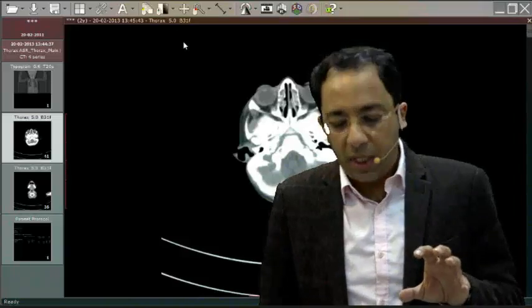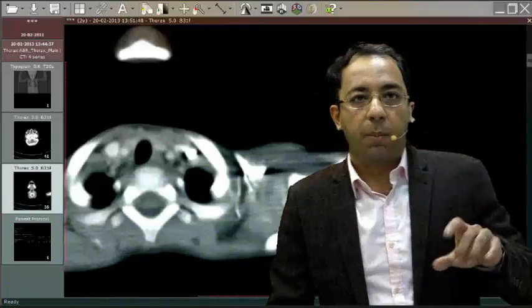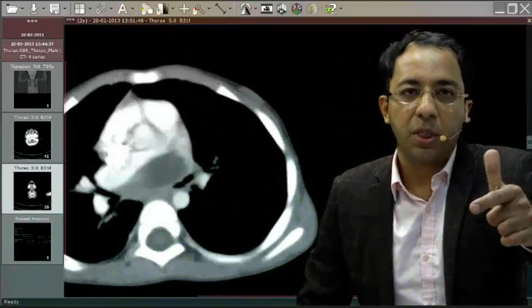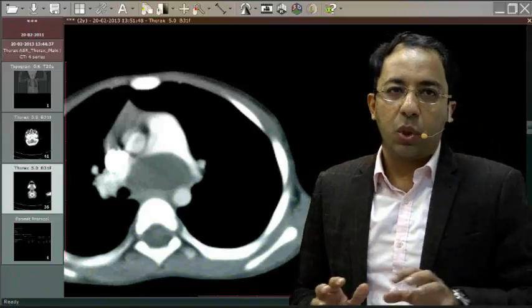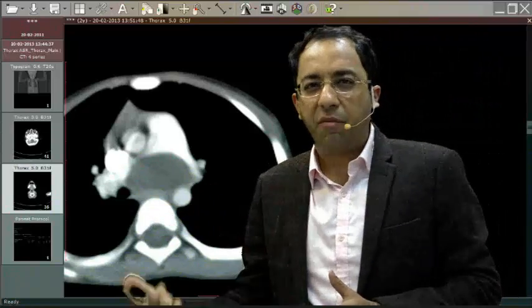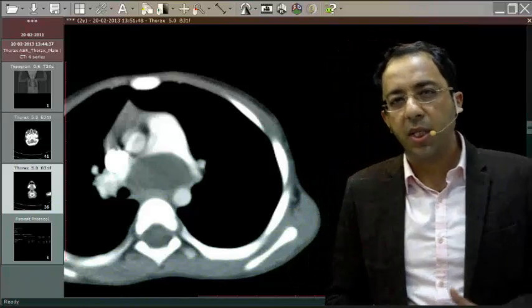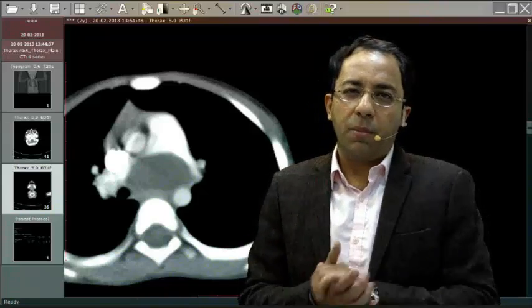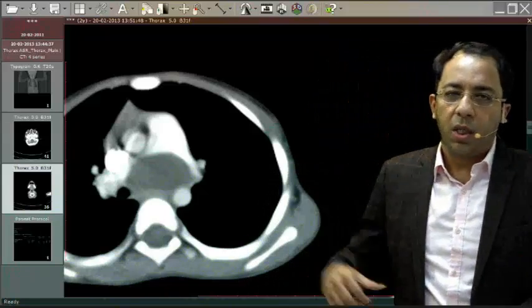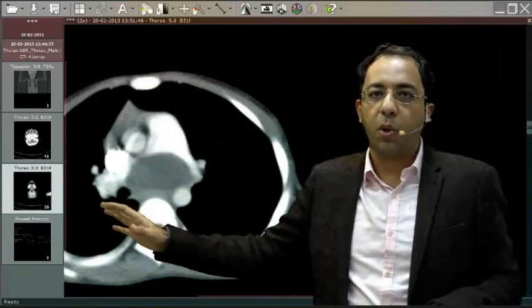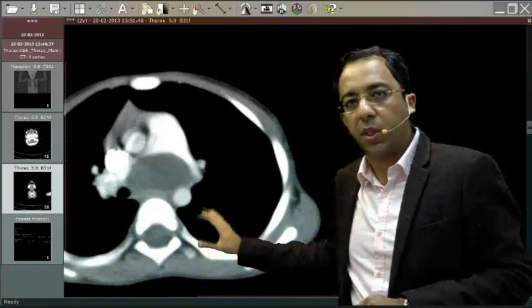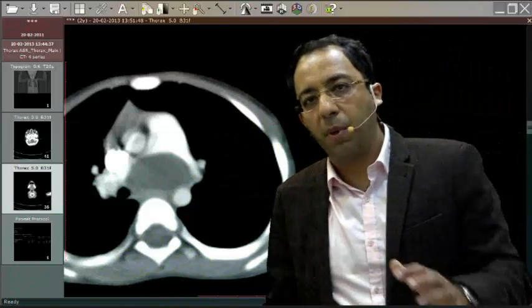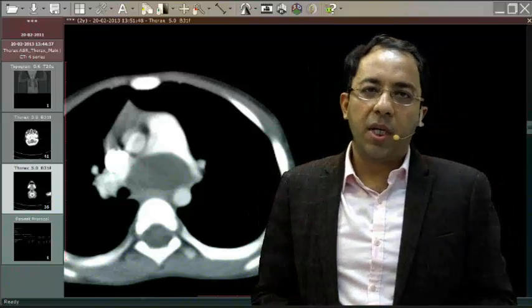These cystic lesions can communicate with the airway as well, but what is going against the airway communication in this particular patient? You don't see any air within. It is clearly fluid-filled, there is no air within the lesion. Had it had some airway communication, we would have seen some air in the lesion. This is purely a cystic lesion sitting at the carina with some narrowing or obstruction, which was mimicking Swyer-James syndrome on the x-ray chest. But on CT we know this is a bronchogenic cyst, maybe leading to some partial obstruction of the left main bronchus, leading to that obstructive hyperinflation of the left lung that we see here.